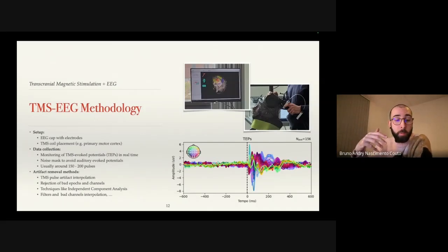You can do that with the patient or the participant's fMRI, or since we have this tool, which I think is quite interesting, you can go functionally to the motor cortex. What I mean by that is that since you can stimulate and get a response out of the hand, you can find where you have the highest amplitude of movement. You adjust the coil there, you find the hotspot, as we call it, which is the brain area where the hand representation is. And then you slowly reduce the intensity until you have no movement, because you want to avoid sensory feedback.